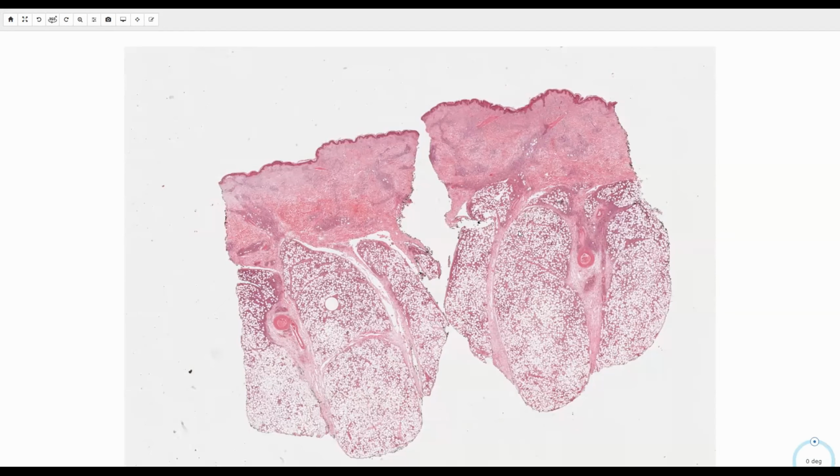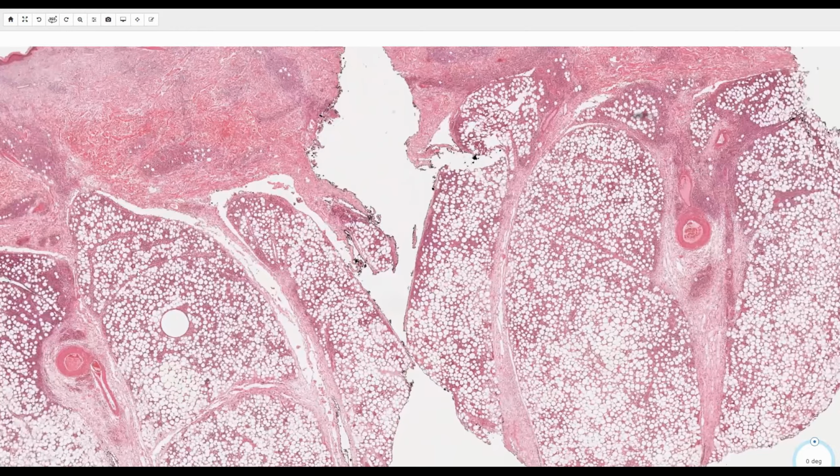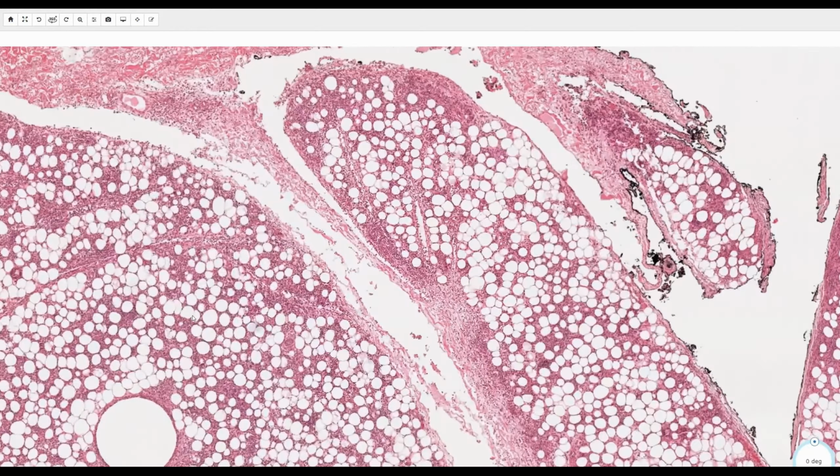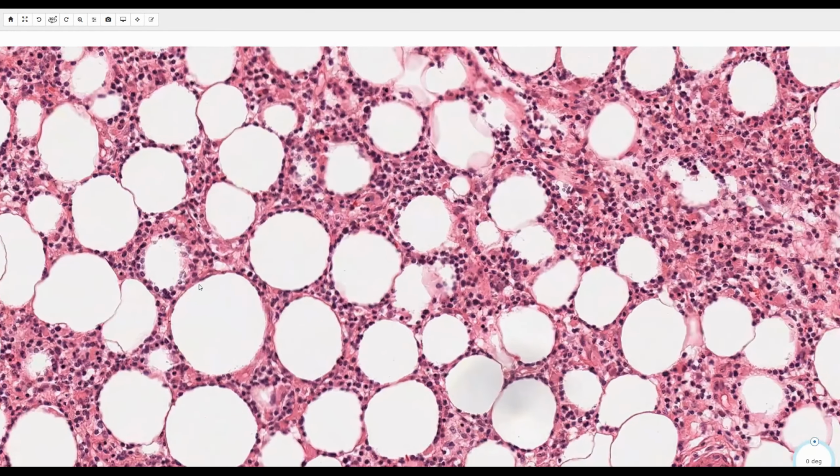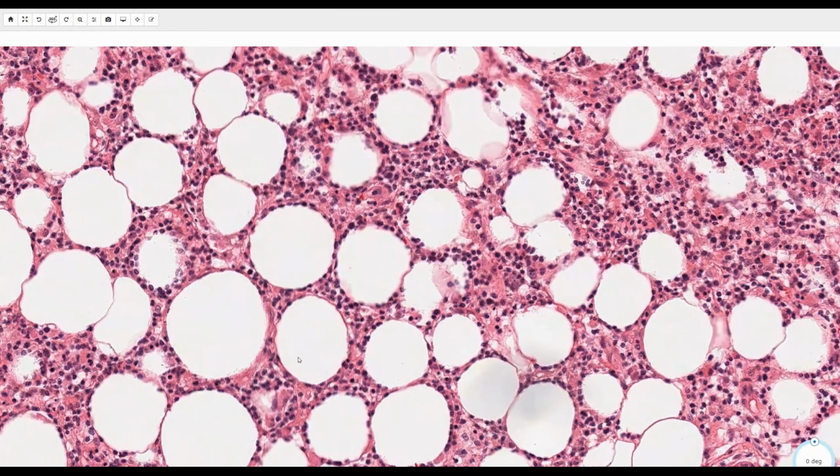And I think here you can see that the majority of the inflammatory infiltrate is centered throughout the panniculus in both the lobular and somewhat septal configuration. So you can see that there's some blue cell infiltrate throughout the septum and then throughout the lobule of the panniculus. And typically when we go in on higher power, the characteristic feature that you see here is rimming of the adipocyte. So what they describe as the inflammatory cell infiltrate surrounding the fat lobule here.